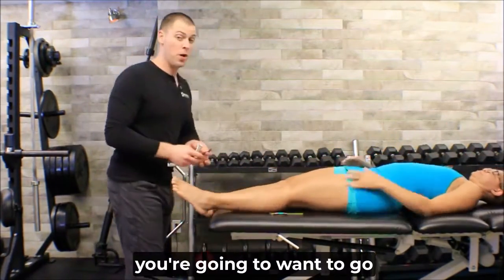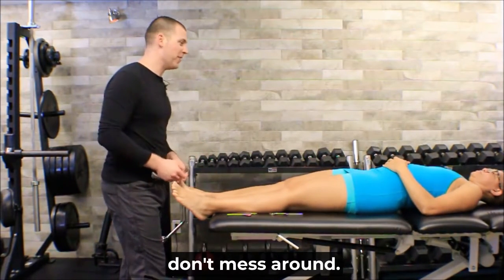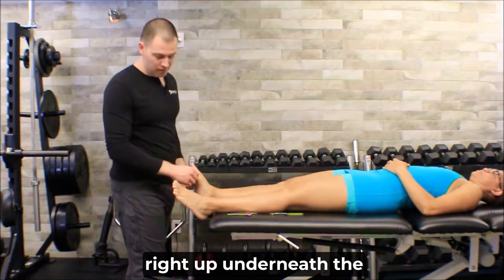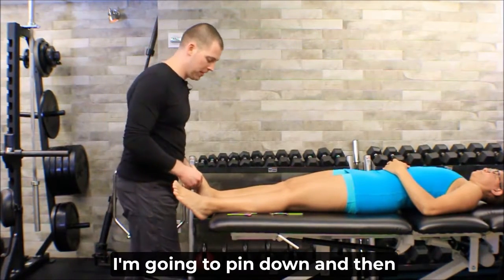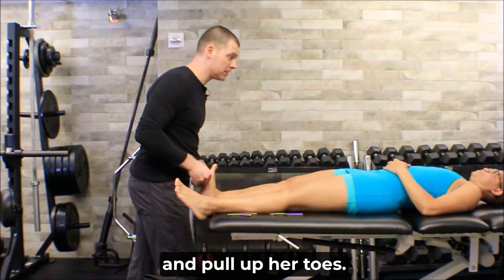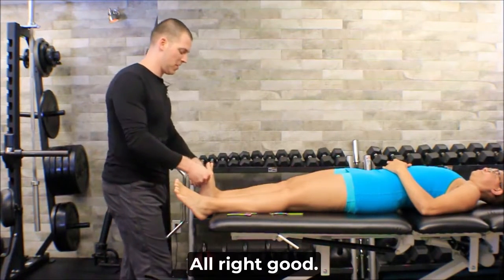And again, guys, you're going to want to go at this with intent. Know what you're doing. Don't mess around. This is not comfortable. All right, but I'm going to go ahead and right up underneath the ball of her foot, I'm going to pin down, and then I'm going to have her dorsiflex and pull up her toes. How's that feel? Tough? All right, good.